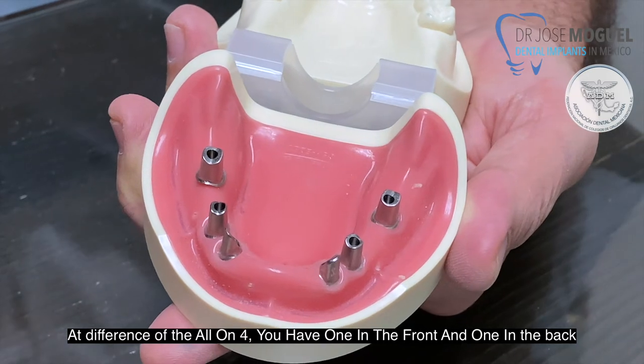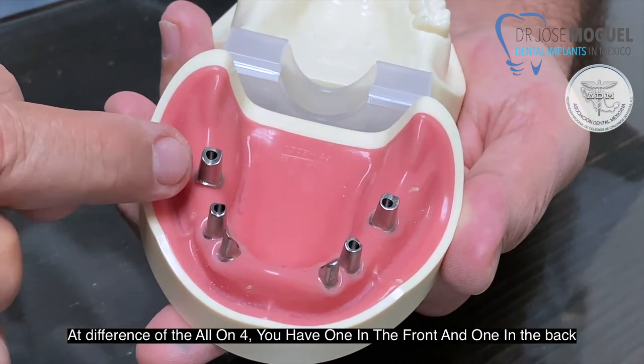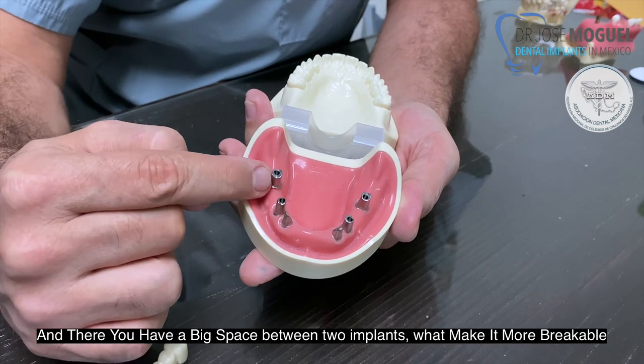A difference with the All-On-Four, where you have only one in the front and one in the back, and then you have a big space between the two implants, which makes it more breakable.